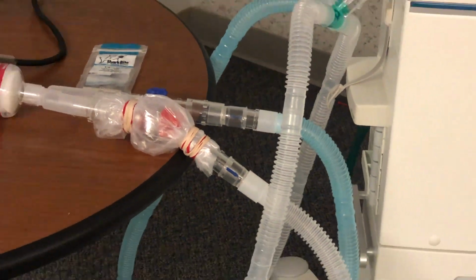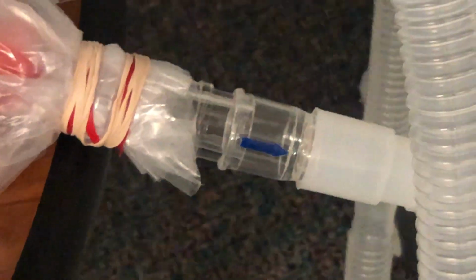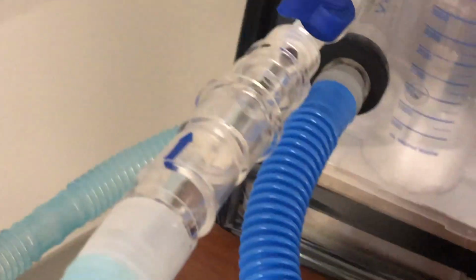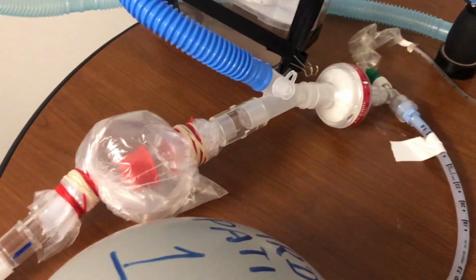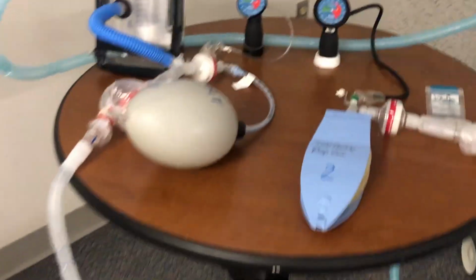So it has to be in both the inspiratory and expiratory limb. If you see, this is a one-way valve which is readily available, and that is another one-way valve in the inspiratory limb. Same thing is happening with this patient. This is a one-way valve, this with the arrow, and then on the expiratory side this is a one-way valve.